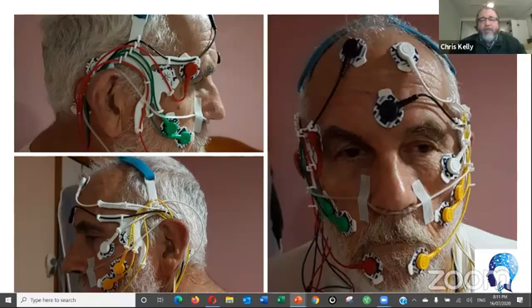So it's more than an oral appliance, it's more than a pair of nose cones, it's more than a CPAP. It's a combination of CPAP and oral appliance. I think that's important to remember. And the more you get into this, the more you need to seek out companies that are going to work with you for oral appliances and CPAP, so that you can put it all together and do the best for your patient.